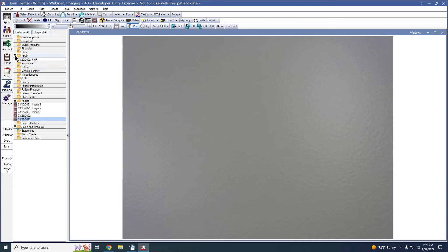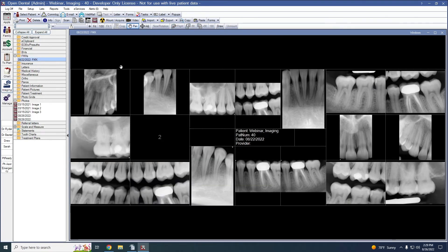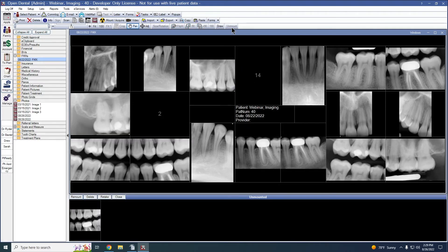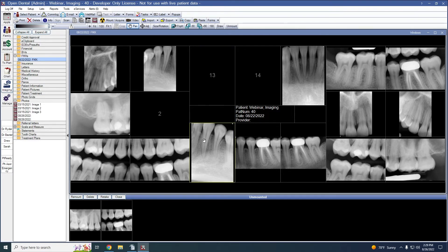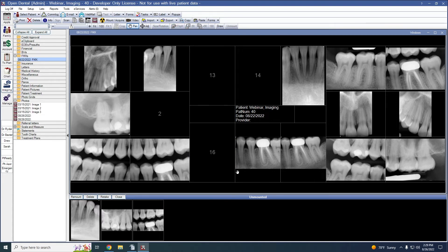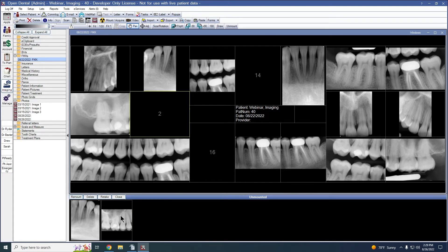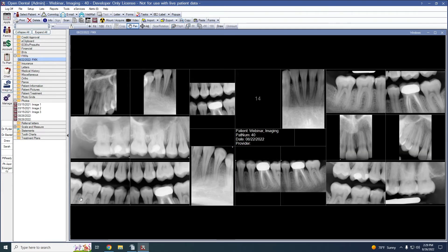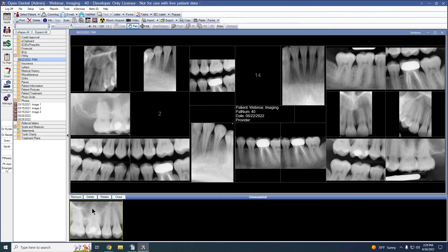Once we've captured images to our mount, it is now possible to rearrange those images. To rearrange images on a mount, we can select our first image and click Unmount. The unmounted images will be displayed in the unmounted section that appears at the bottom of the imaging module. We can unmount multiple images at once. To remount an image, select an open spot on the mount, select our image and click Remount. It's also possible to delete an image from our mount by selecting the image and clicking Unmount, then selecting the image again and clicking Delete.